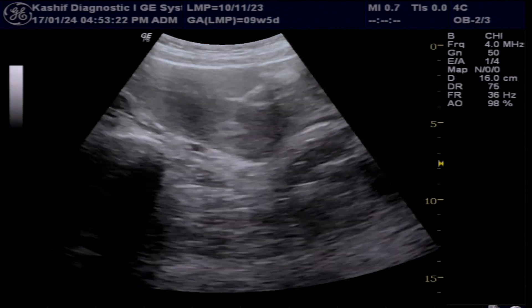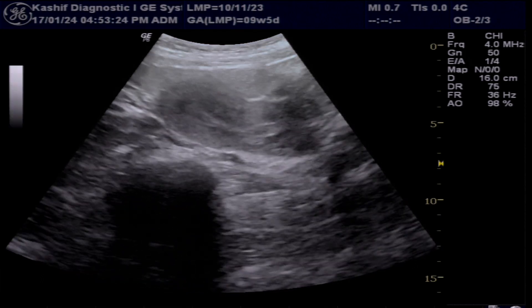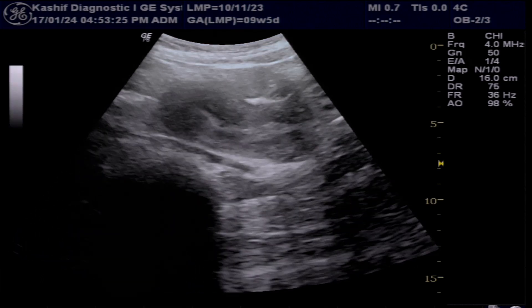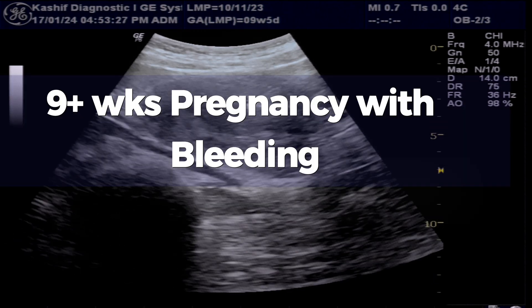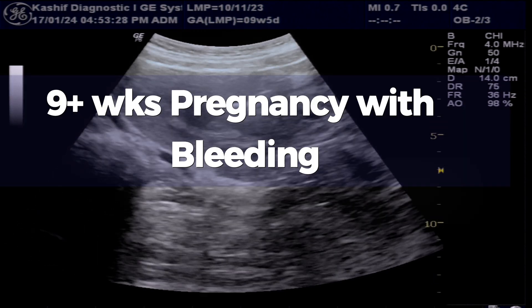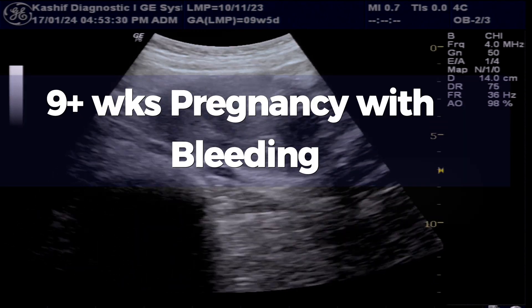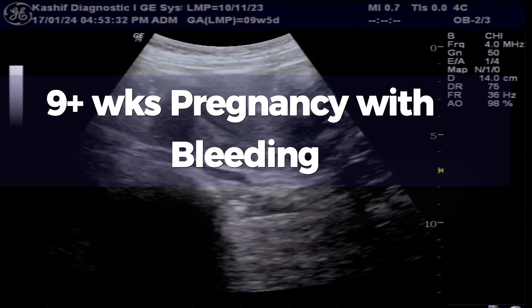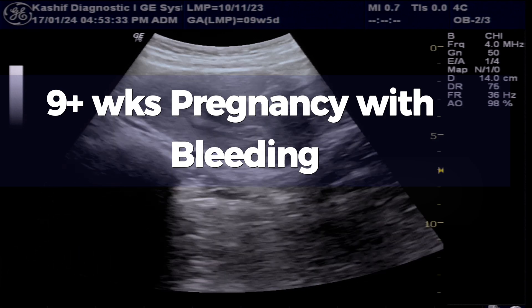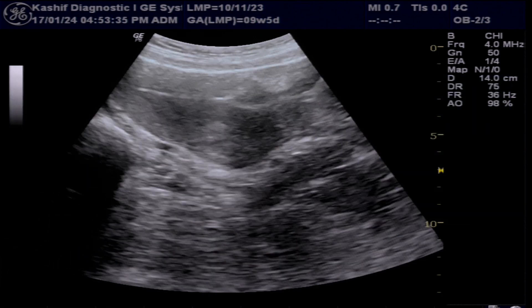This is a very rare ultrasound case of a 27-year-old female. According to LMP, she is 9 weeks and 5 days pregnant. She has a history of bleeding and pain for 4 days.